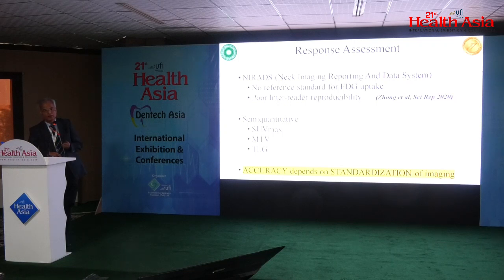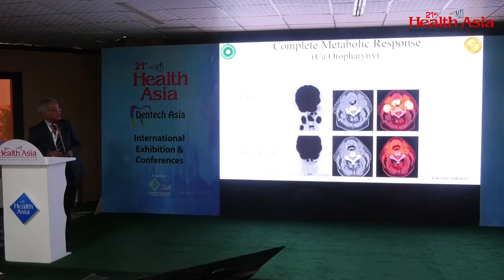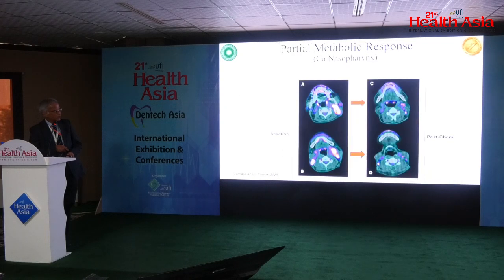This recommendation has been categorically stressed by the European Association of Nuclear Medicine guidelines in 2015: standardization is very important when using FDG PET-CT for precise metabolic response assessment. This is an example of a hypermetabolic primary tumor in the oropharynx with bulky hypermetabolic nodal disease, and 3 months post-CRT there is a complete normalization of abnormal metabolic uptake, consistent with complete metabolic response.